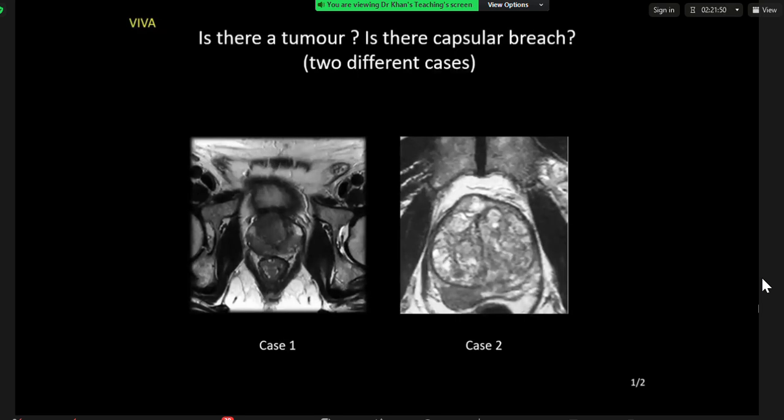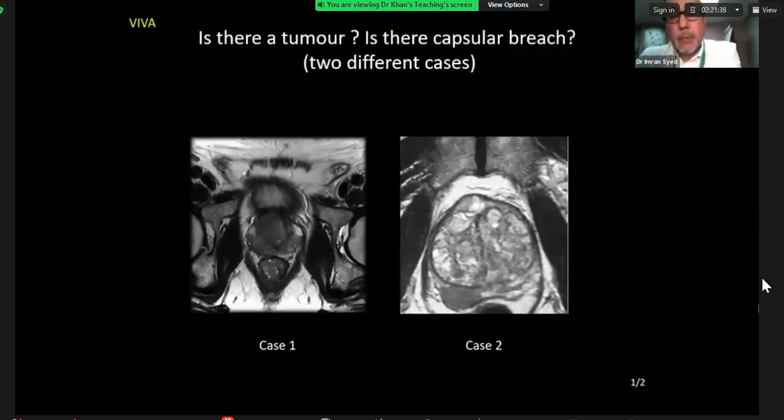Okay. Right. So again, remember what we've said, and what I emphasise is descriptive abilities, and that's key. This is to all the candidates that are listening. I'm particularly keen for you to be able to describe something such that at the end of a telephone call, I know what you're talking about as your consultant. And so to this end, we'll describe what you've just said.